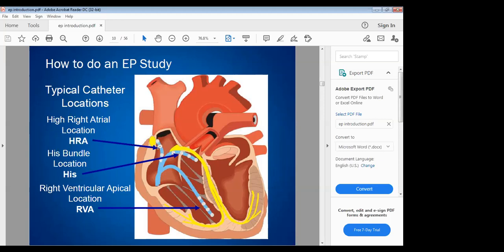Okay, sorry. Yes. My question is, I understand what you said about the sinus cycle length. So the operator can determine how long that wants to be. By the time you pace and you allow the cycle to go round, can you still wait a while and say, okay, let me wait more time to repace if I want to? Or by itself, it will automatically restart the whole cycle again. Or is the operator that determines, okay, I want to pace now, even before this cycle ends, I want to pace again? Or what determines that? Thank you.